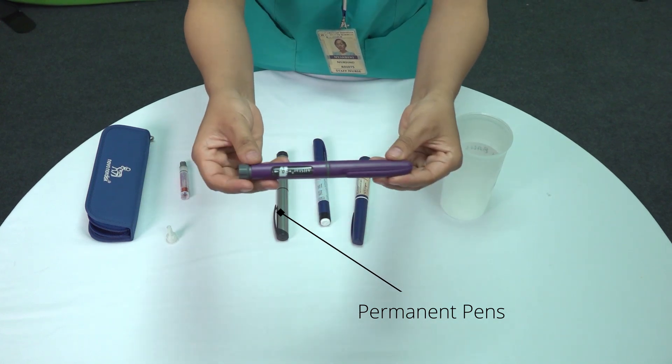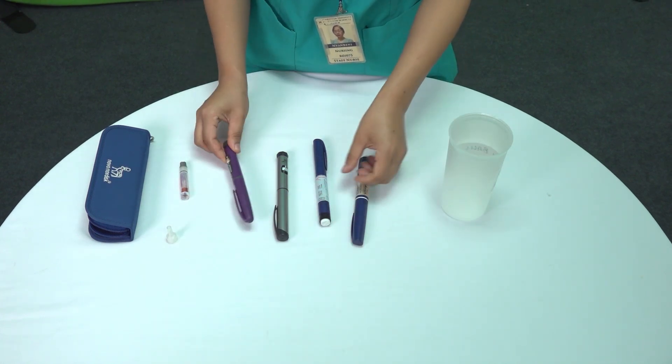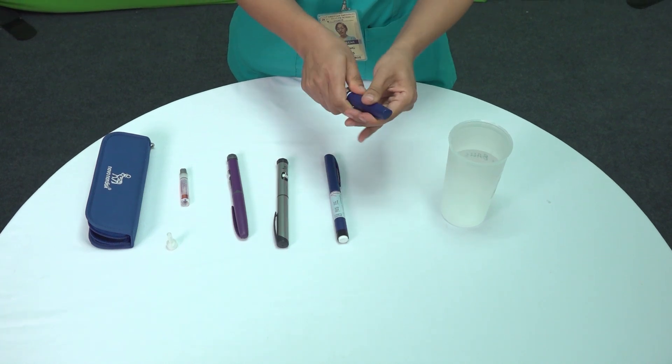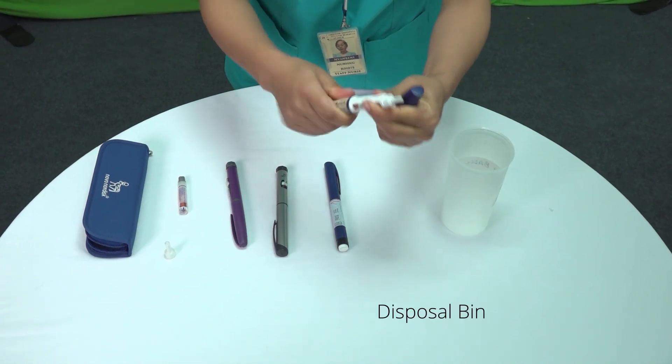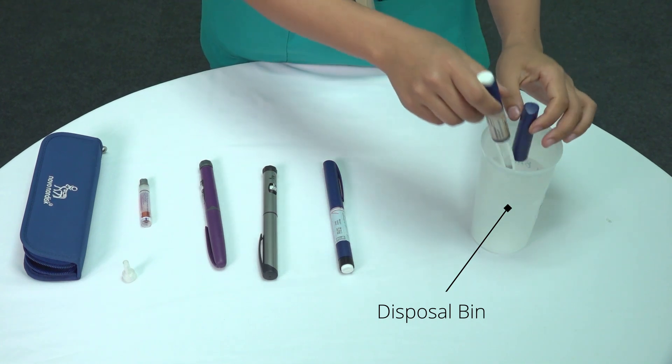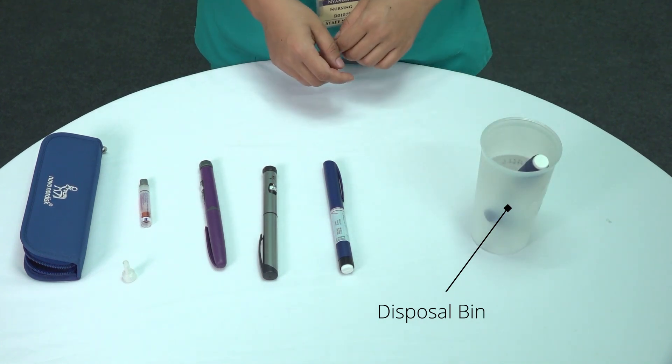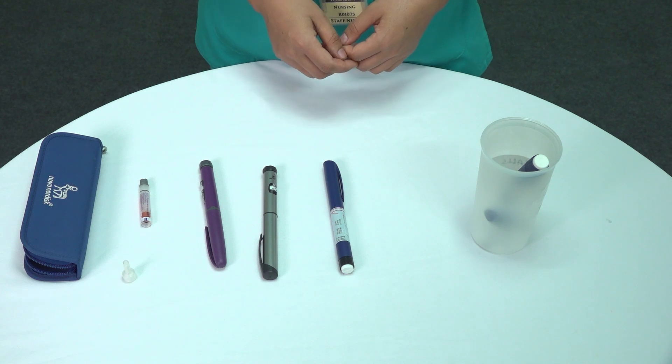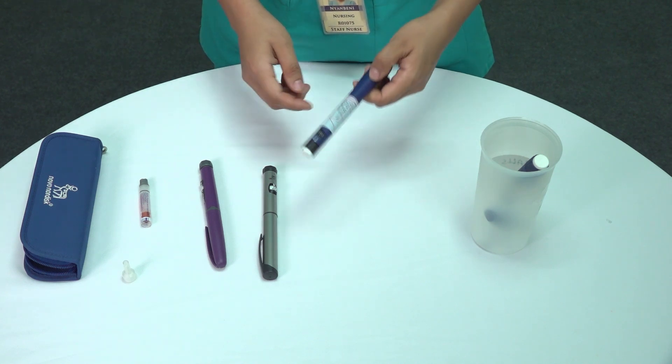Let's start by explaining each one. First up, temporary pens. These are disposable pens, which means the insulin cartridge cannot be replaced. Once the insulin runs out, the entire pen is discarded. A great example of a temporary pen is the FlexPen.